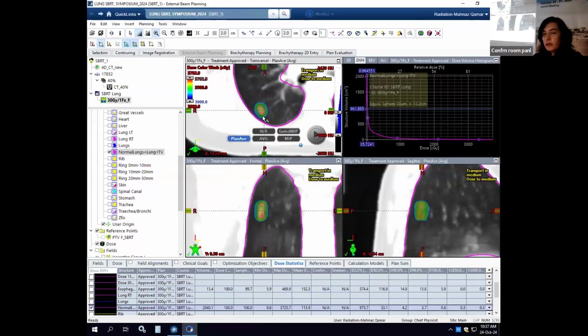So, it's a very good question. We do not have a compression board. We actually tried to get that, but we haven't been successful yet. We do have the compression belt. And initially, when we started the program, we did try to use that, and we haven't been really successful with it.